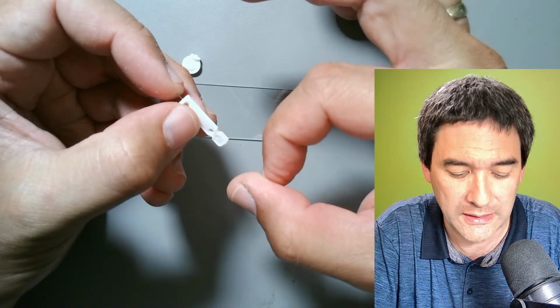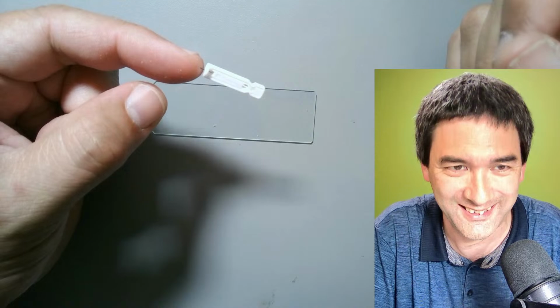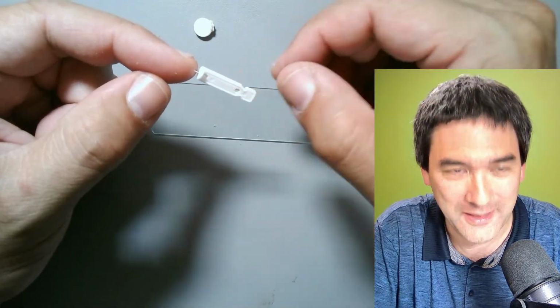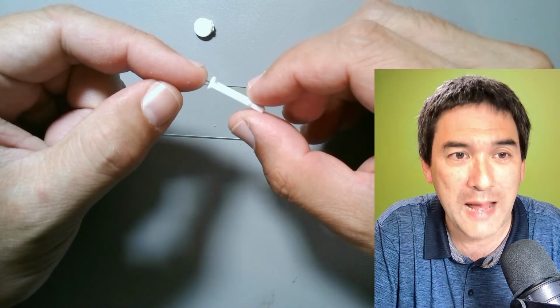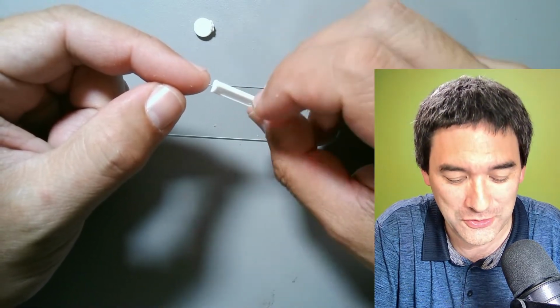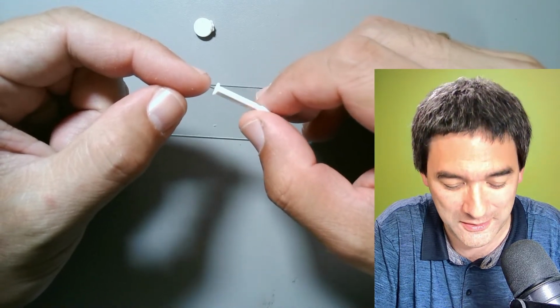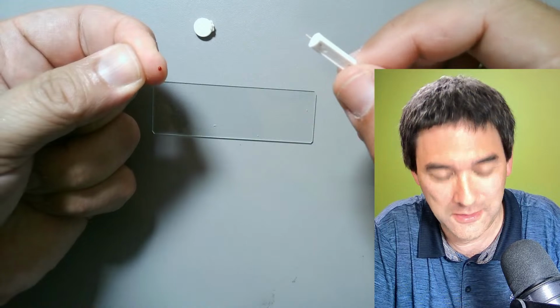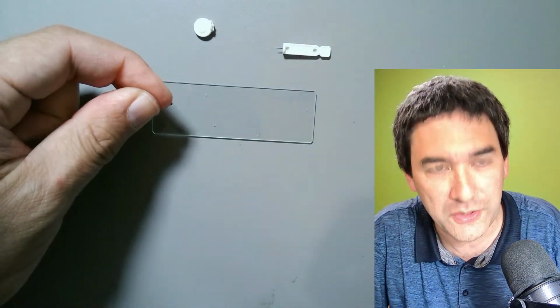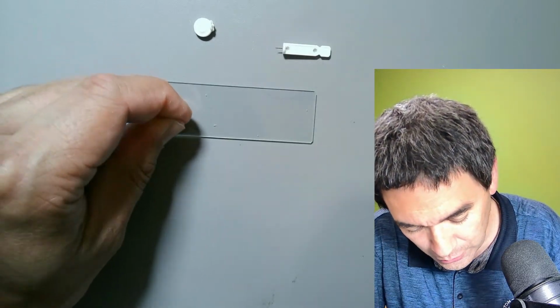I will try it simply like this. Okay. It's easier this way. It only hurts at the very beginning, and there are lots of blood capillaries here in the fingertip. Turning it also hurts a little bit, but this actually means that maybe more blood vessels break, and here we go. Ta-da! Am I happy? What I do is I apply a small drop of the blood here, not on the corner, but on the side.